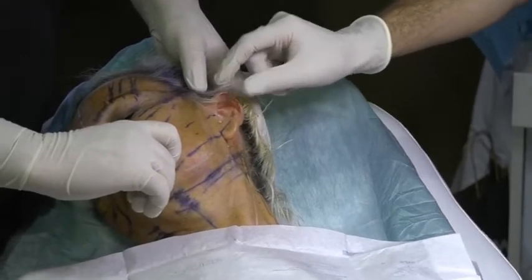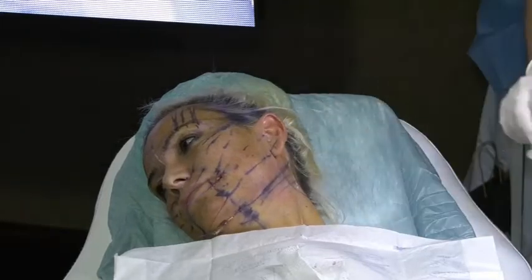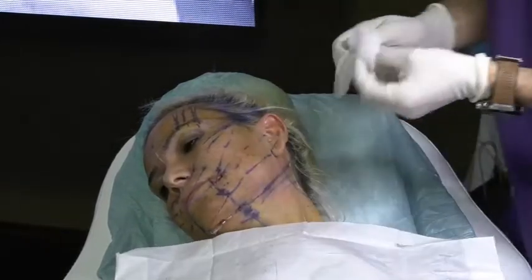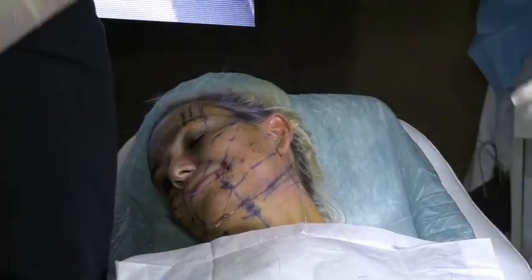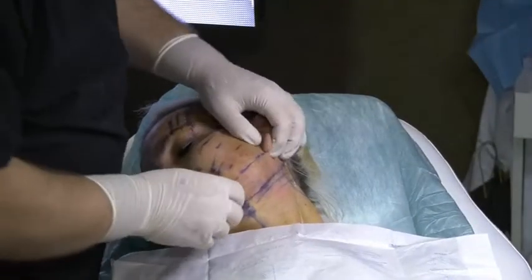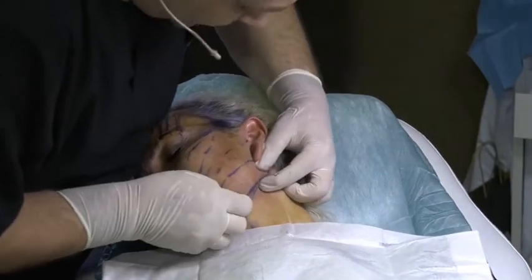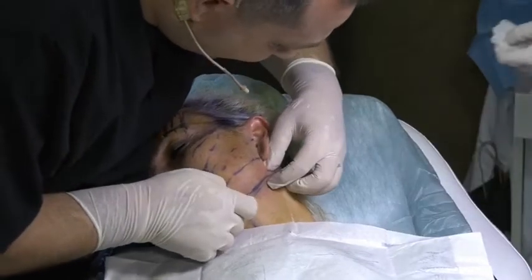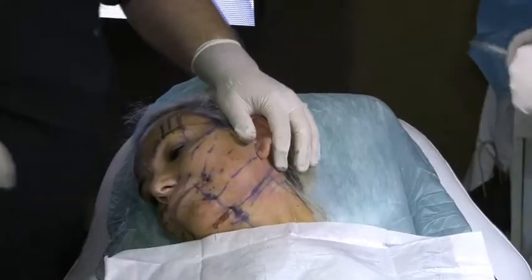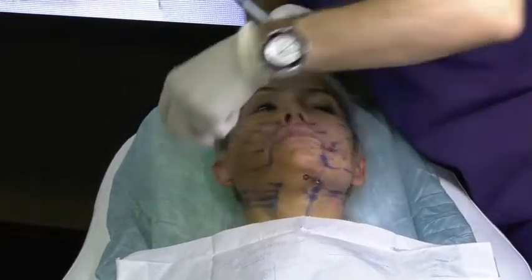Not stay at the hairline. The hairline is so early. There's no big deal. I don't have to make it in one time or one push. Just slow. Just slow. This is very uncooperative model and I don't like that. Okay? Try to handle with me the pain. Put anesthesia on the other side here, because this is the painful area. Look, I take long time, but at the end, what did I do? I pass. Because I slow.